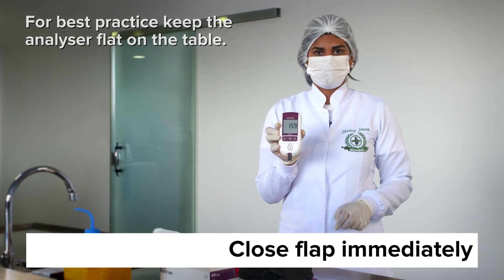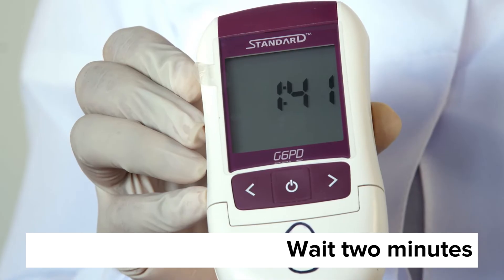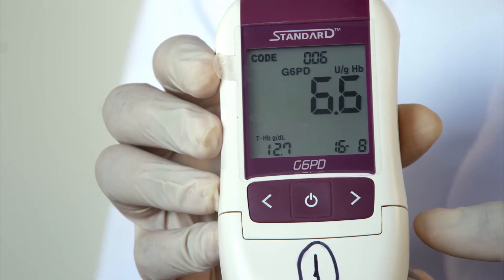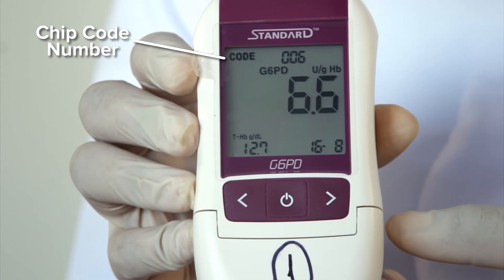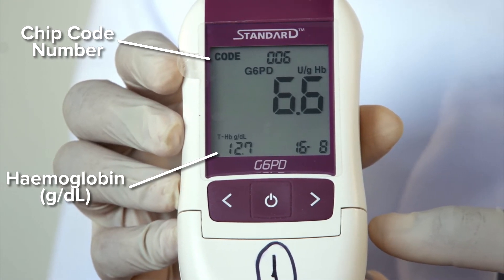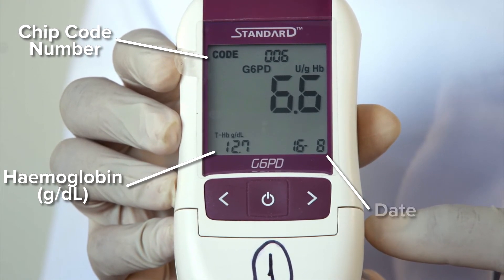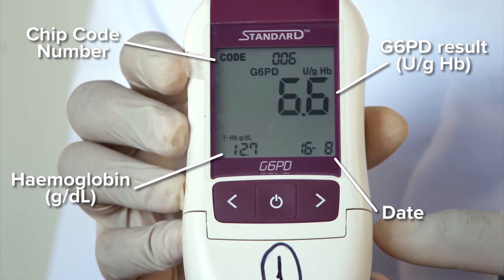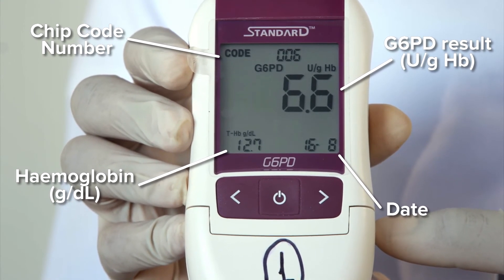The analyzer will now begin counting down two minutes. When the time is up, the analyzer will display the following information: the chip code number, the hemoglobin measurement in grams per deciliter, the date, and the G6PD result in units per gram of hemoglobin.